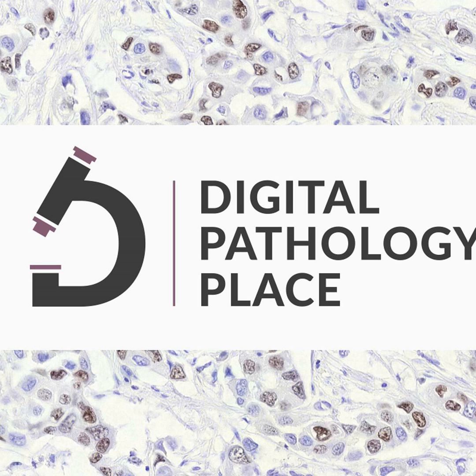You compare the detection of the model to what the pathologist annotated. They know what it is, it's explainable, but do they all annotate the same? I'm not the same in the morning versus in the evening. So there's intra-pathologist variability and inter-pathologist variability.